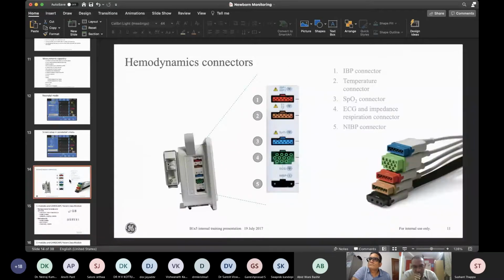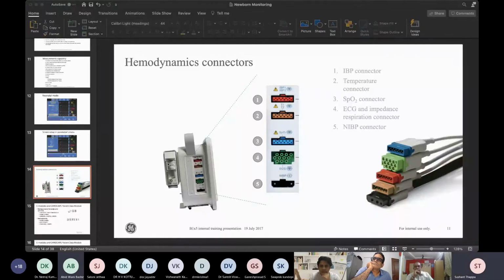So Philips uses something called Fourier artifact suppression technology, and Masimo uses something called SET technology. What is the technology used in GE SpO2? Sushanth, you are there? Hello, yeah, go ahead. I think I disconnected. Can you repeat that, please? Okay, so Philips uses the SpO2 technology called Fourier artifact suppression technology, and of course we all know Masimo uses SET technology. What technology does GE use?